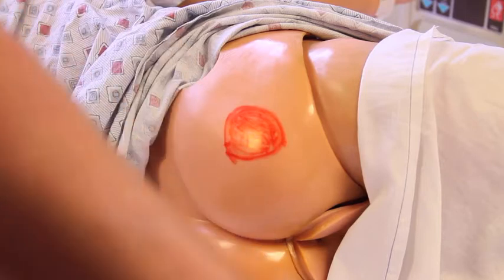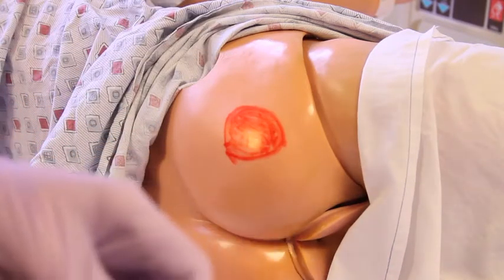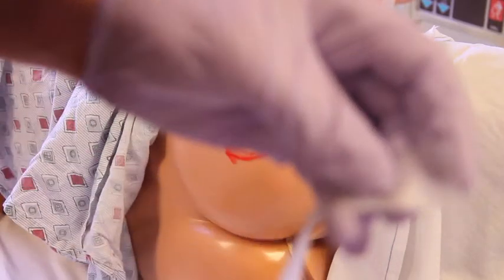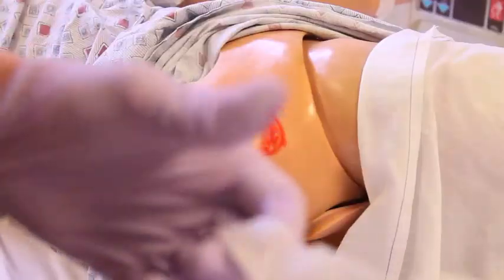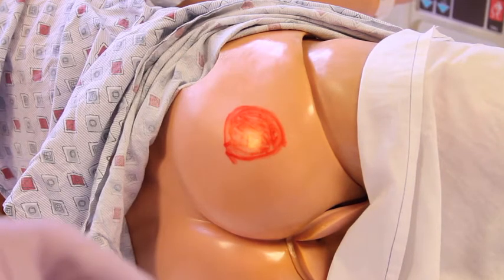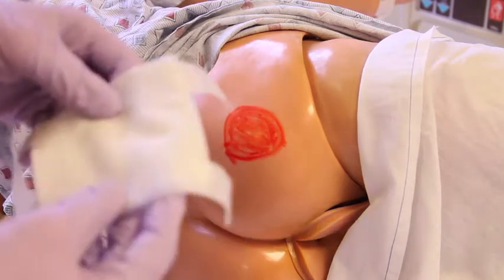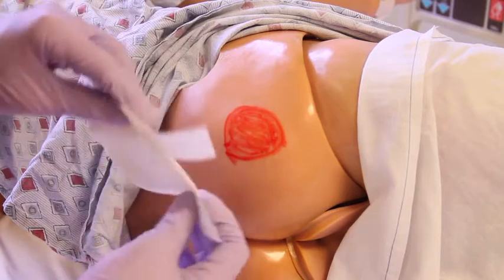So after that, you grab a new gauze that you have prepared.